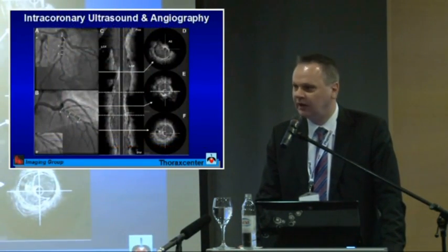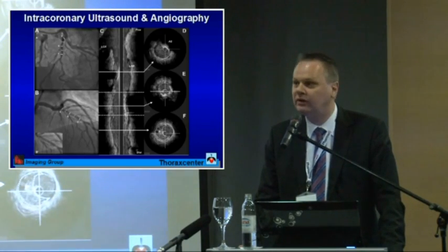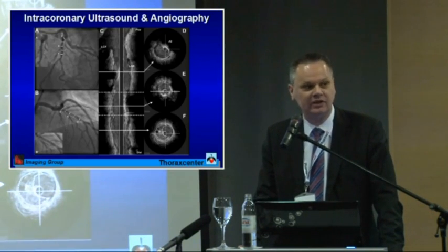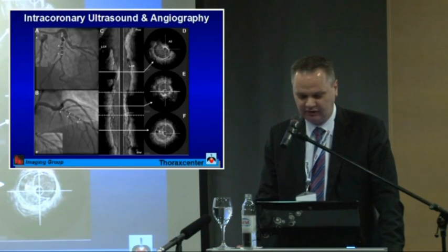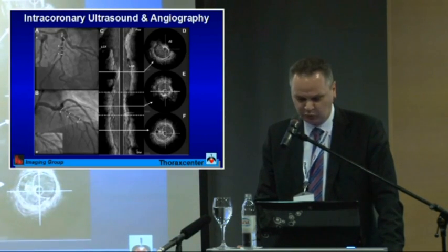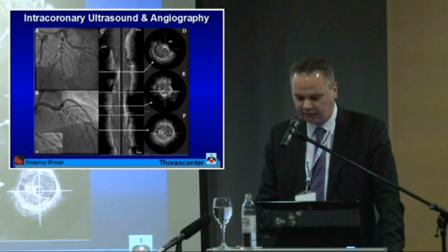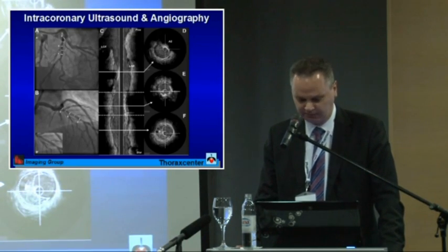Now I want to draw your attention to the angio images here in A and here in B. If you look at that, you see some irregularities, but not actually very much. And we visualize actually only the lumen. If we now use intravascular imaging techniques like intravascular ultrasound, you can see here, proximal of an implanted stent, these dashed lines identifying an implanted stent, that we have a large acoustic shadowed area which identifies that there is a lot of calcium.